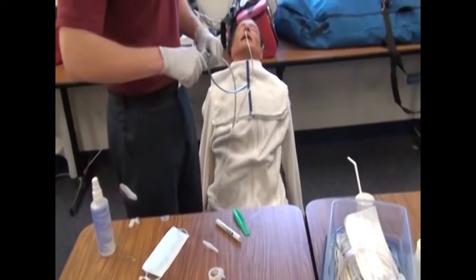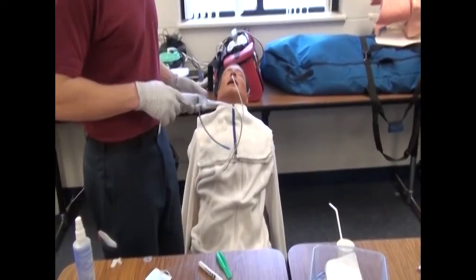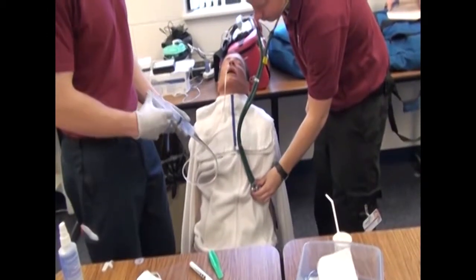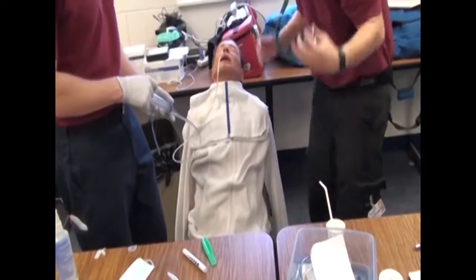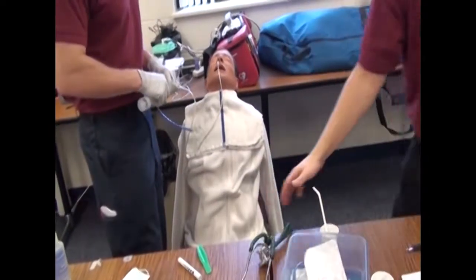Aspirate back in syringe to obtain gastric contents. If no contents are aspirated, ask client to roll onto left lateral position and check again. Then, over the left upper quadrant, inject 10 to 20 cc's of air, listening for whooshing sound. If tube not in stomach, advance another 1 to 2 inches and repeat previous step.